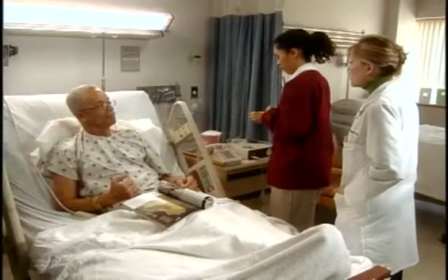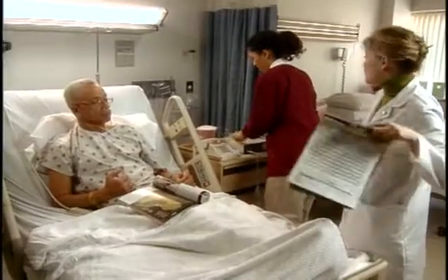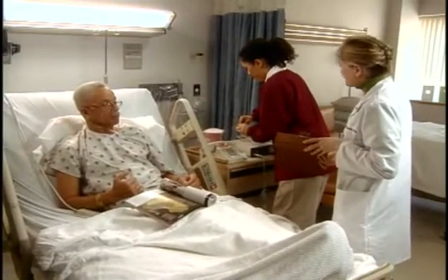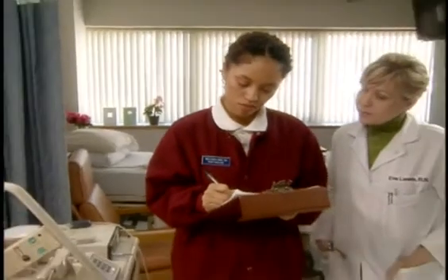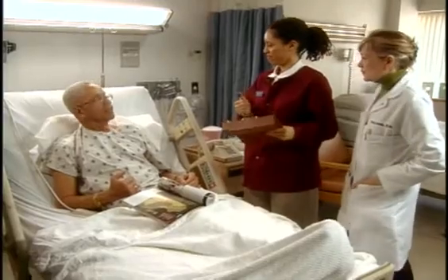Oh, that's good. Any non-disposable sensors should be cleaned, and don't forget to document the oxygen saturation reading in the patient's record. Thank you. Will do. All right, Mr. Howard. You're all set. Thanks a lot. Okay.